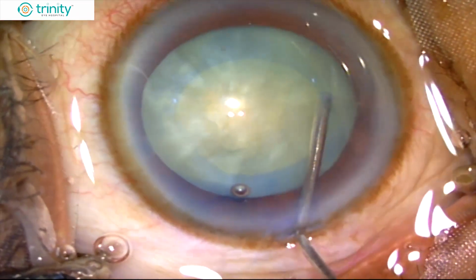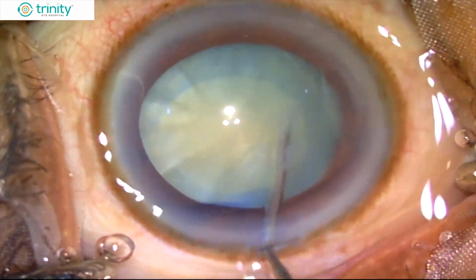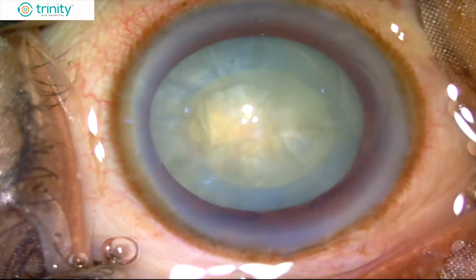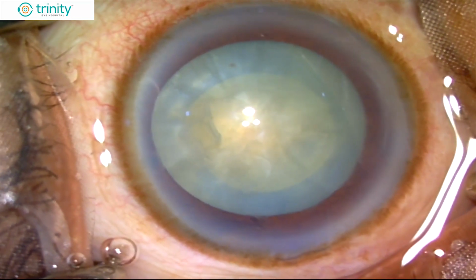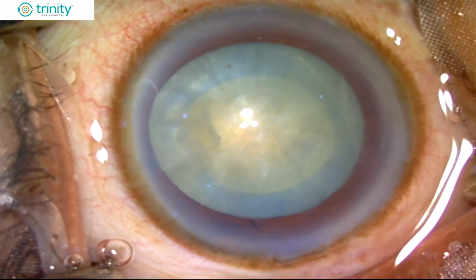Hydrodissection is not very much needed in these cases because it's a white cataract, and it's better to avoid too much hydrodissection because of the fear of blowout. So now I'm putting in viscoelastic again. I've checked for the mobility of the nucleus with the hydrodissection cannula itself. So I'm not going to dial the nucleus again.